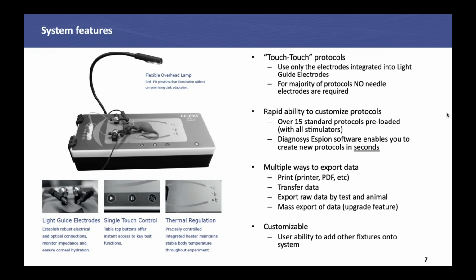Remember, we published that probably 15 years ago. Me, David Birch, Don Hood, and David Pepperberg doing the 2-flash to isolate the in vivo rod response. I'm pretty sure you guys can do that, but we have not done that yet. It's a good example of something to work on together.